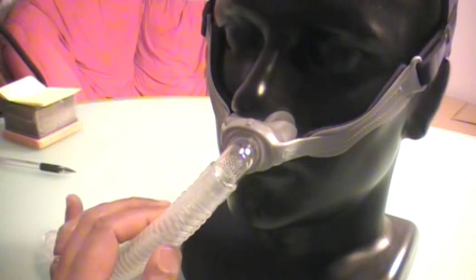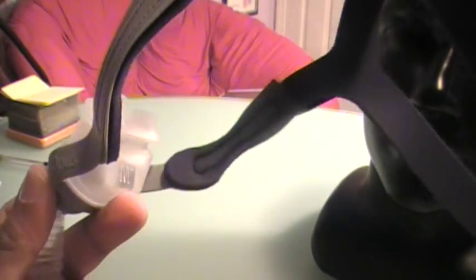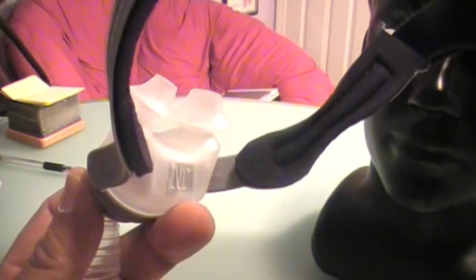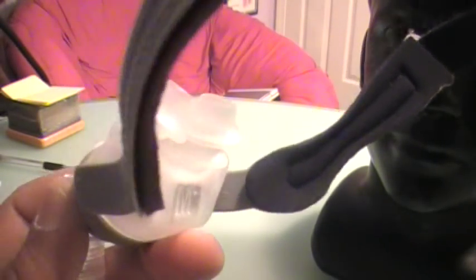The cushion comes in small, medium, and large — can you see it says M? Those are the three cushions that come in the box. Do yourself a tremendous favor: make sure when you get this nasal pillow that the Home Medical Equipment Company gives you all three sizes, because you can play around with them to find the best fit.